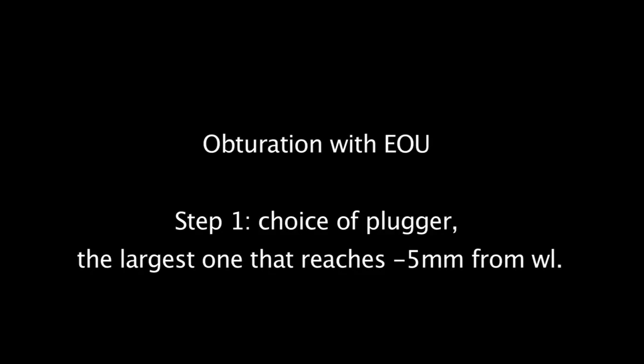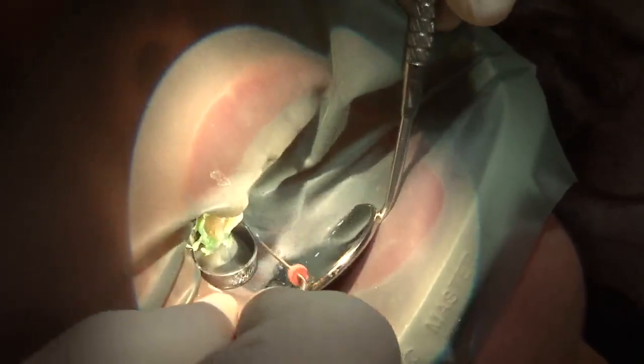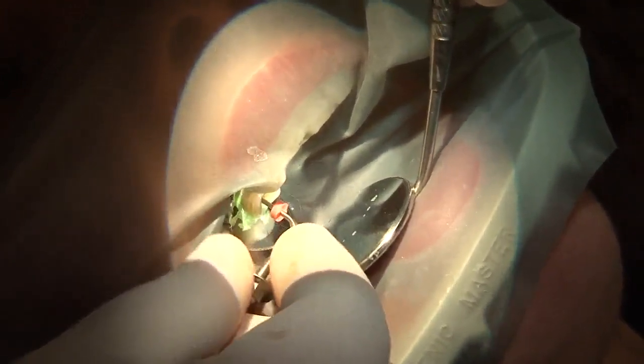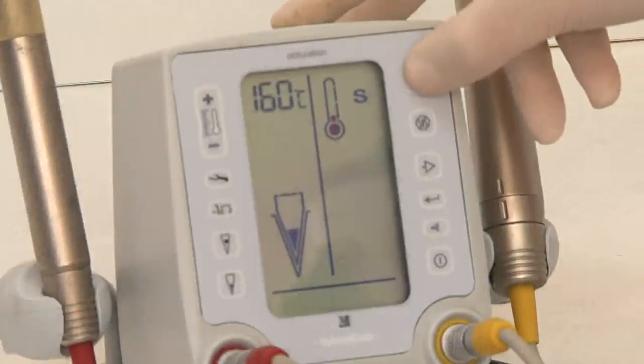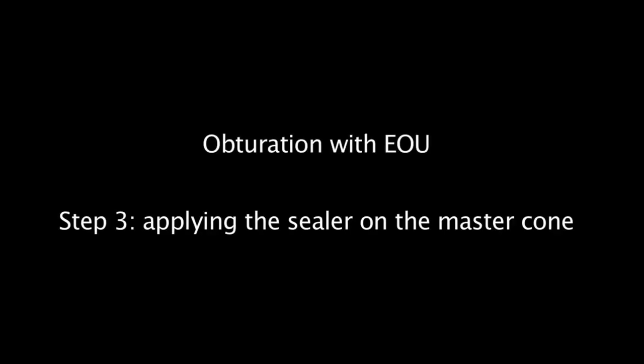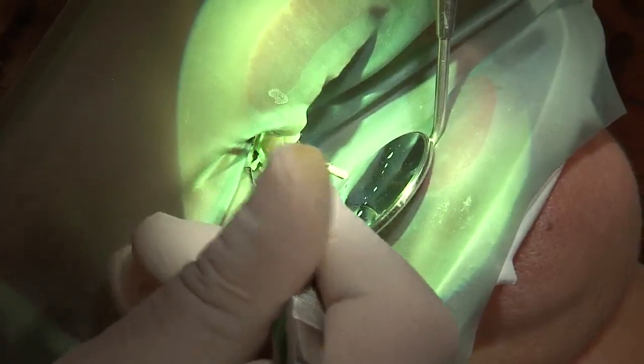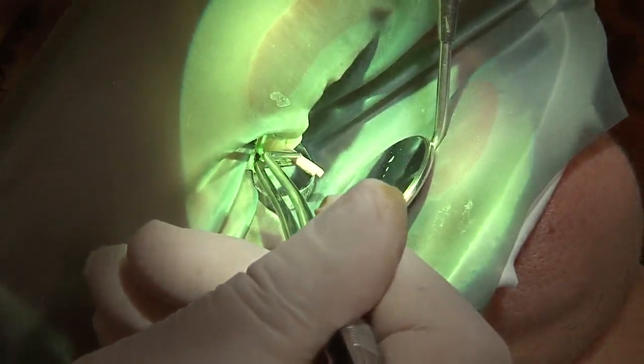It's time to go to the obturation using Element obturation unit. Step one is going to be the choice of our pluggers. It's going to be the largest plugger that will reach minus 5 millimeters from our working length. We tried them first. Again my point of reference was the palatal cusp. So we need to choose the largest one that will go there. Adjusting the unit. First we switch to S which is going to be synthetic for RealSeal, and the temperature is 160 for the down pack. We put a bit of sealer on the master cone. I switch on the filter light on my microscope in order to avoid any chemical reaction or light curing of the sealer. Both master cones are inserted.